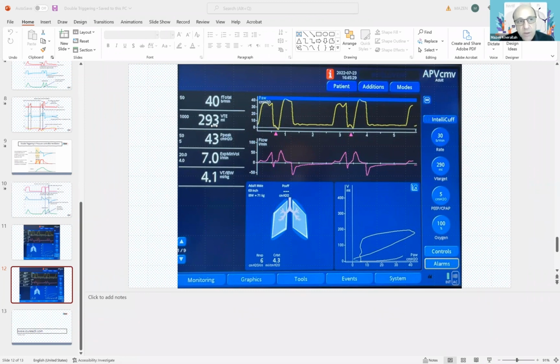Now, the answer to this, if this is the case, all falls within protective lung strategy. Do you really want to give him larger tidal volume? Or is this the tidal volume that he needs to get based on the protective lung strategy? If your calculations are wrong and you need to give him higher tidal volume, you would set higher tidal volume for the patient within protective lung strategy.